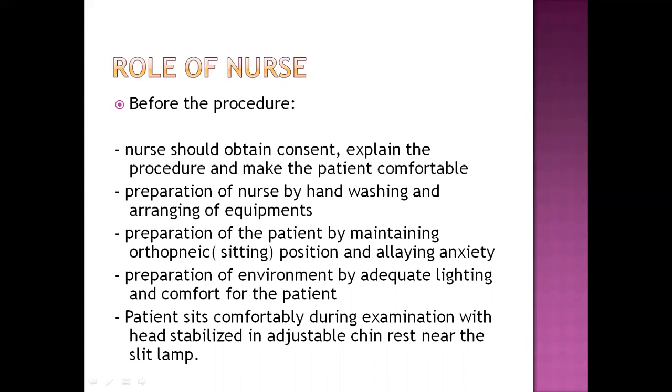Patient sits comfortably during this examination with head stabilized in an adjustable chin rest near the slit lamp. So the slit lamp is a device designed in such a way that chin can rest and eyes can be exposed towards that light.